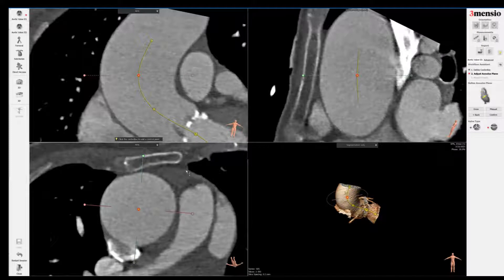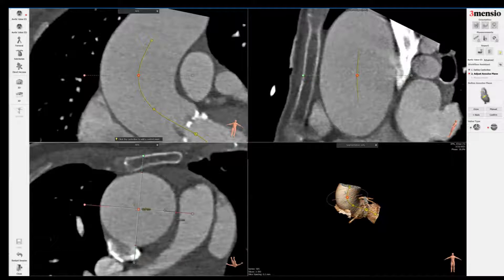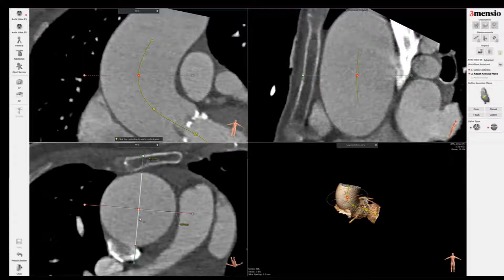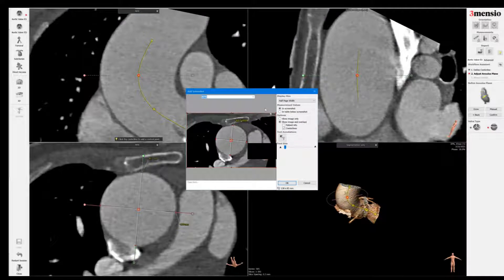This patient probably has an ascending aortic aneurysm, so what you can do is measure the ascending aortic diameter. You can see here on both long and short axis it's over 4.5 centimeters. So for this patient we would recommend surgery over TAVR because we need to have concomitant ascending aortic replacement, and I can also save this as a screenshot to illustrate that.